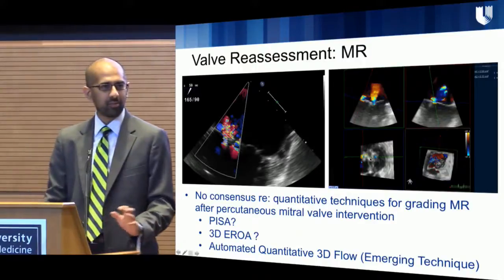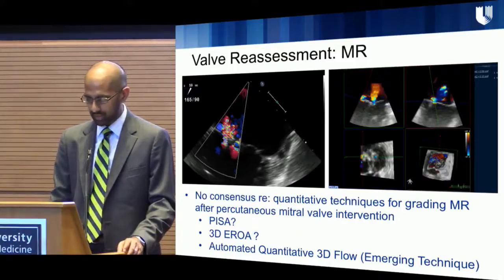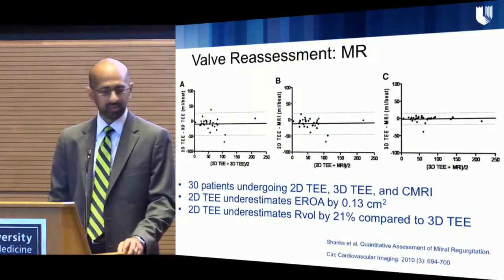Never, never. It's some irregular shape. You don't have to make those assumptions when you use 3D color TEE. Okay, so what's the data for that?